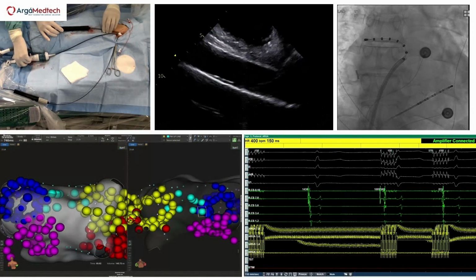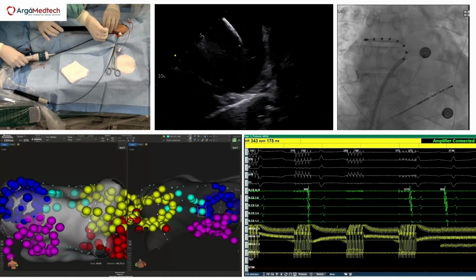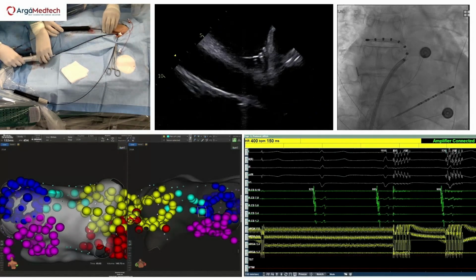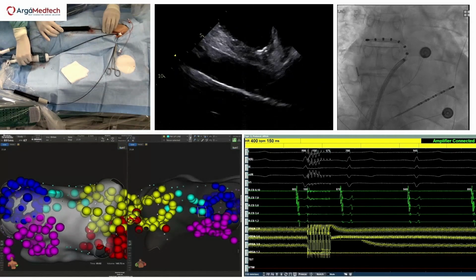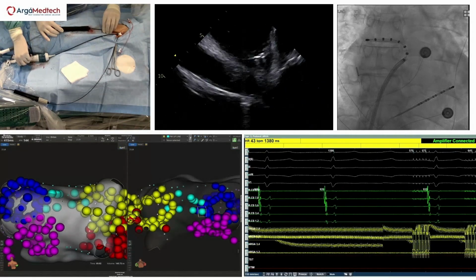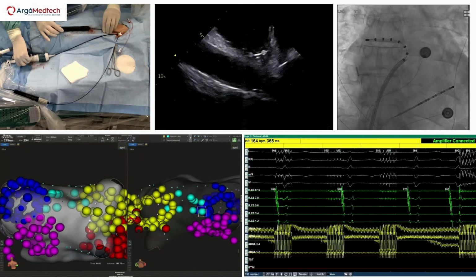After this, we're done. And then I'm going to go in a 1, 2, then we stay in the linear. We're going to anchor it in the left inferior. Once we anchor it in the left inferior, we're going to probably do 1 4 standard because we don't really need 8 millimeter depth there. So we're going to do 4 standard. And then we're going to continue with focal ablation to isolate the posterior wall.